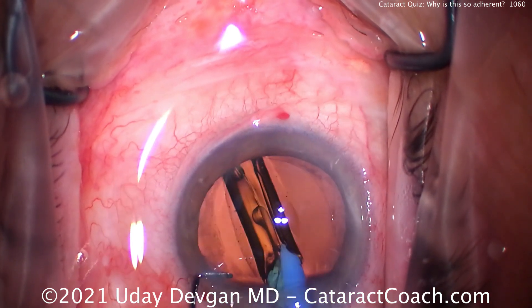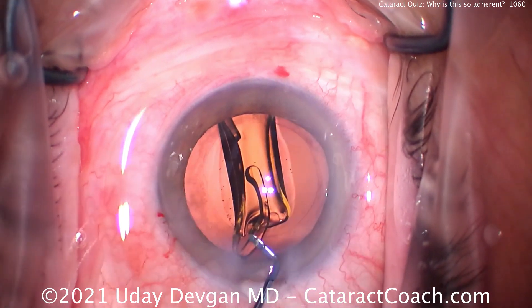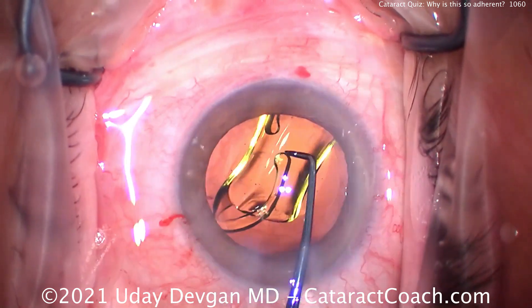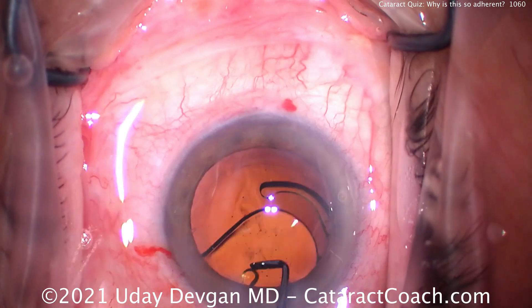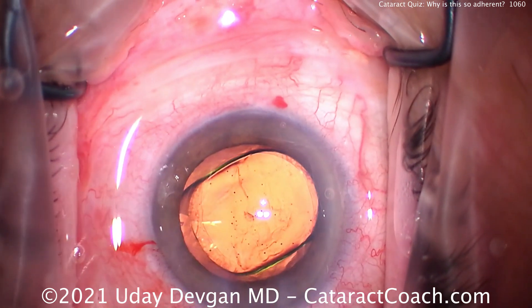The lens is loaded beautifully — good job by the technician. We'll make sure the entire lens goes into the capsule bag behind that anterior capsule rim. Let's rotate the lens a little bit and get those haptics to unfold. That looks darn good.